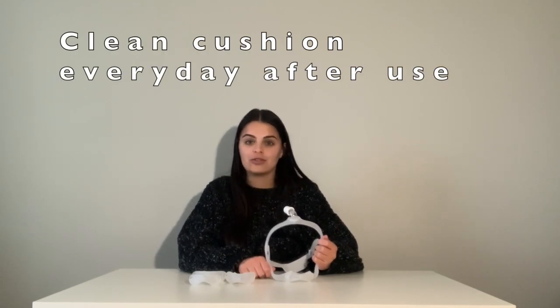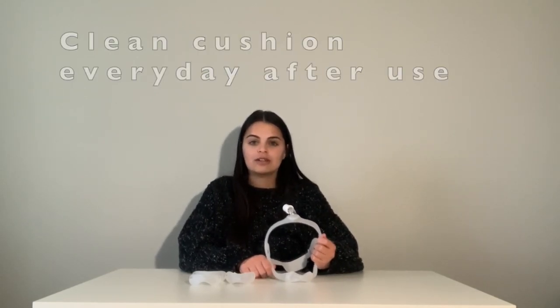Cleaning your equipment is very important for an effective CPAP therapy. Be sure to clean your cushion every day after use to remove any residue. To clean, simply use warm soapy water or a CPAP mask wipe daily. Make sure your cushion is completely dry before inserting it back into the frame.